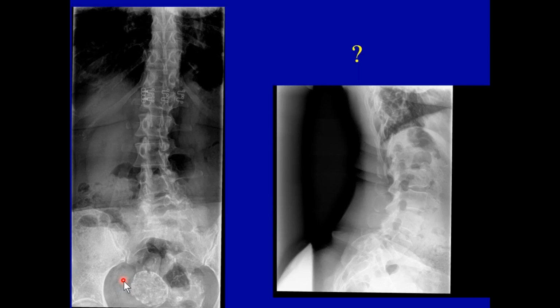If there's any doubt, if this was a lot smaller, the examination of choice is a diagnostic ultrasound of the pelvis. Ultrasound has now received application to the musculoskeletal system, and you can do an ultrasound of the rotator cuff and get the same information as you could from an MRI. The point to this is, these are common in older females.